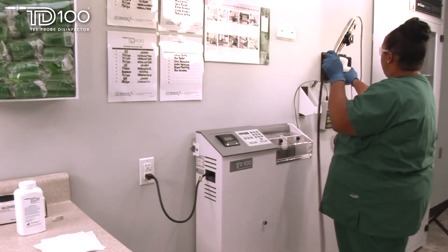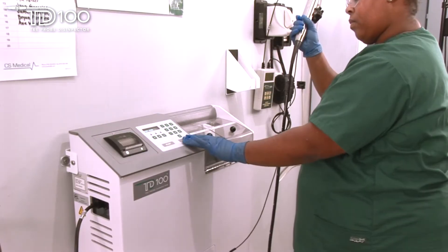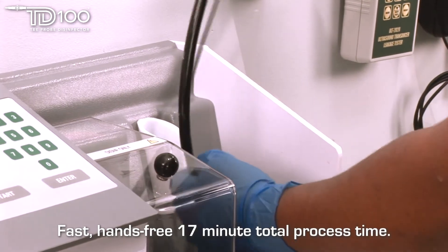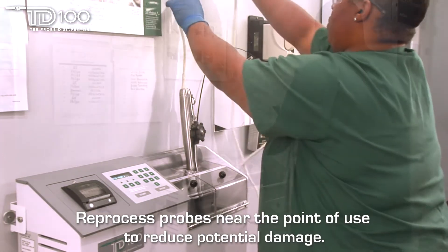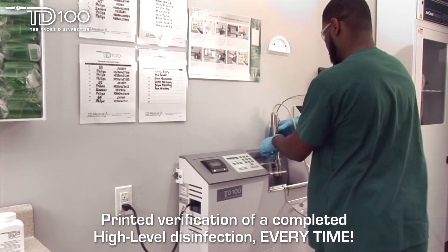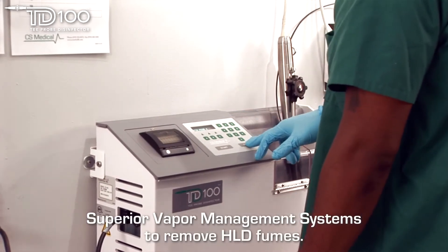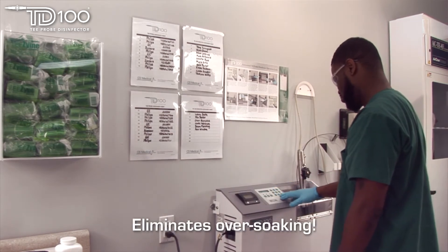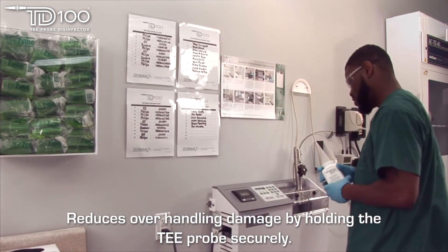By incorporating the TD100 automated disinfector into your hospital disinfection program, you will gain the following advantages: a fast, hands-free turnaround of 17 minutes — about half the time of the manual process; allows you to reprocess your probes near the area of use, dramatically reducing the potential for damage; generates a printed verification at the end of the completed disinfection cycle that records disinfectant contact time and temperature; reduces the risk of exposure to harmful high-level disinfectants; eliminates the potential for over-soaking the TEE probe; and reduces handling that may cause probe damage, resulting in costly repairs to your TEE probe.